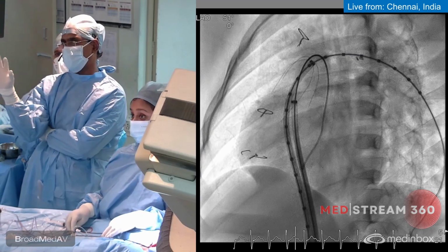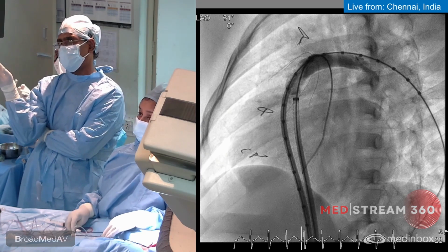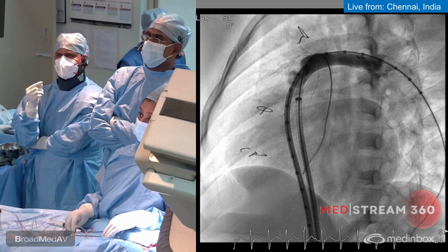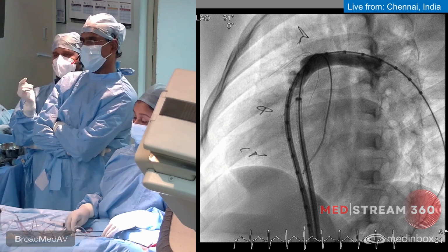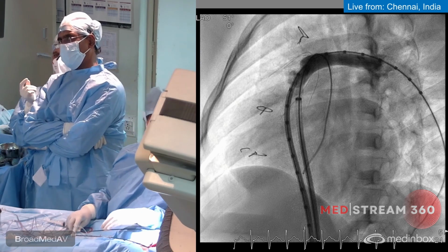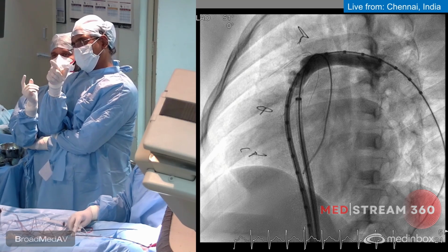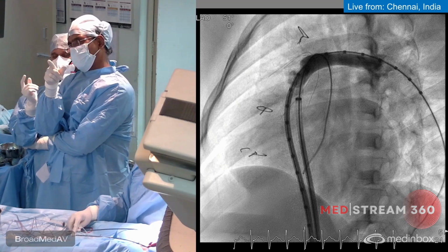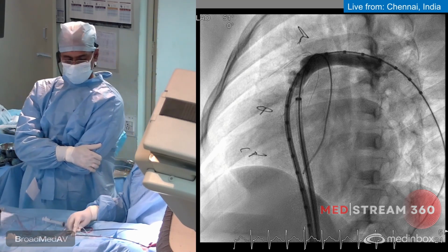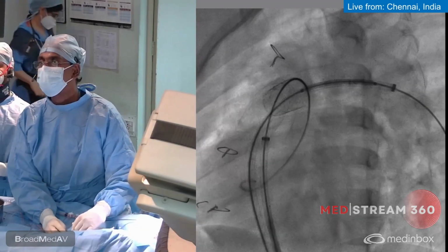Just empty the contrast. Let us see the number of holes. Now you start going onward. Okay. Next frame. Enough. So here it's 1, 2, 3. Definitely, it looks like almost 4. We have to capture that LPA origin as well. The LPA origin is now in this frame exactly below the first sternal wire and above the sheath tip. Can you see that? Yes, sir. So from that point onwards, we have to capture it. I'm going to peel back the sheath.